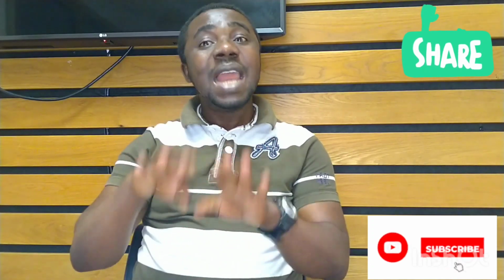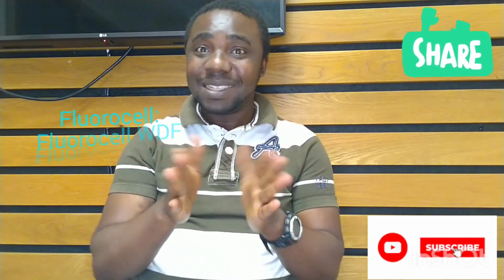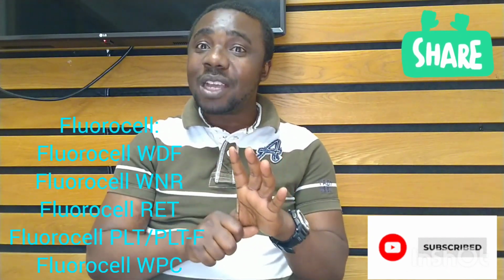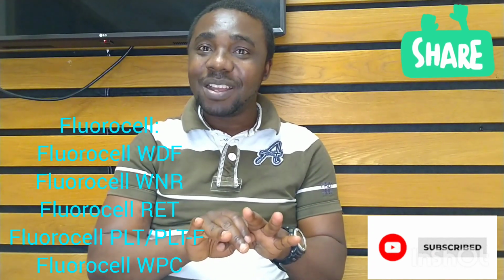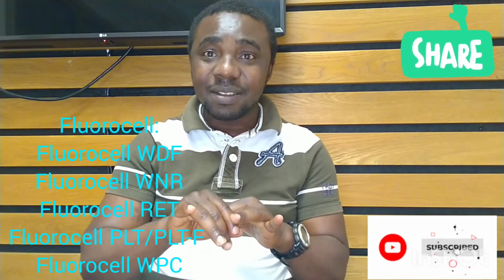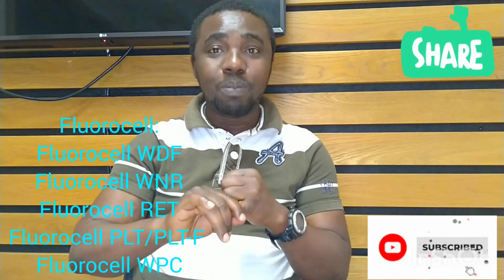Now the next one is Fluorocell. The same thing. You have Fluorocell WDF, Fluorocell WNR, Fluorocell reticulocyte, Fluorocell platelet, and also Fluorocell WPC.